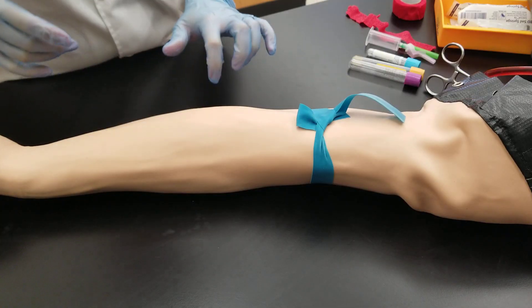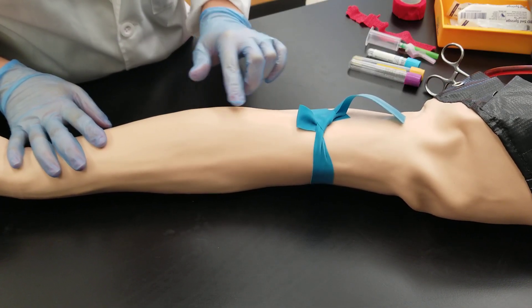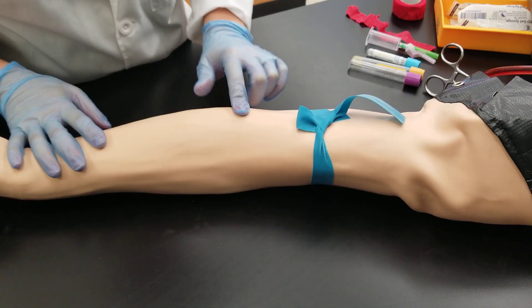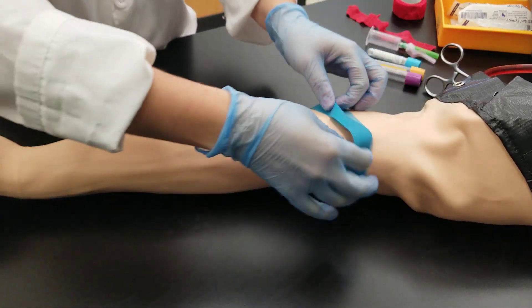I'm going to assess the patient's veins, and it looks like this is a good one. So I'm going to remove the tourniquet.